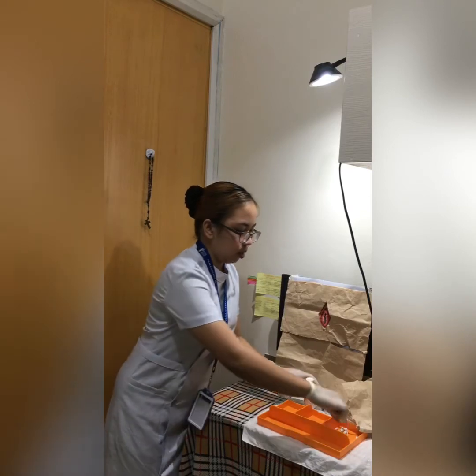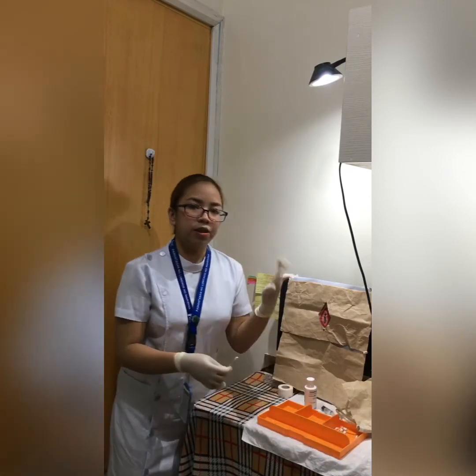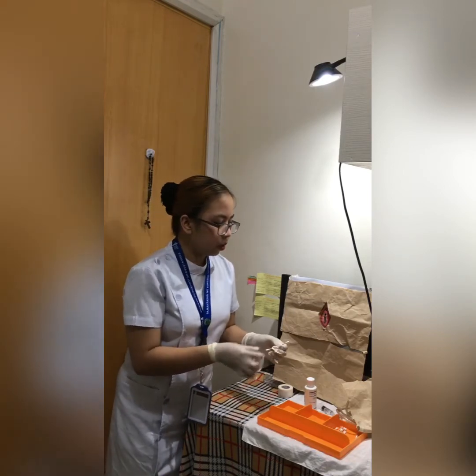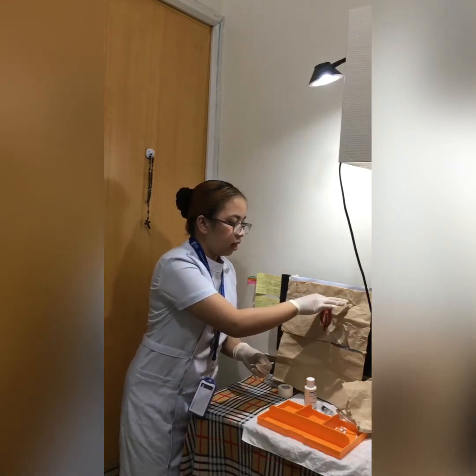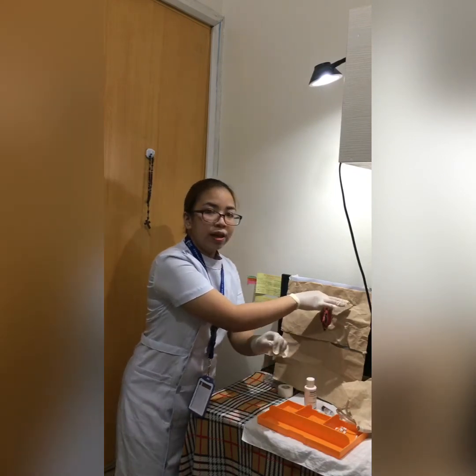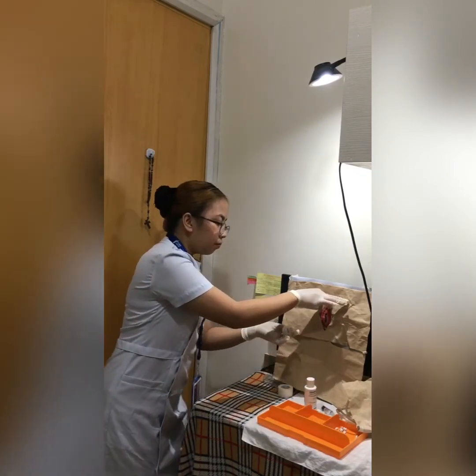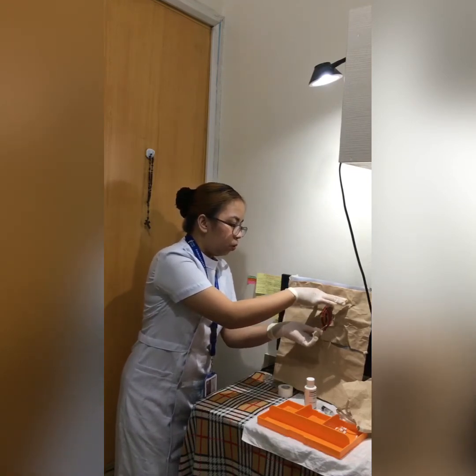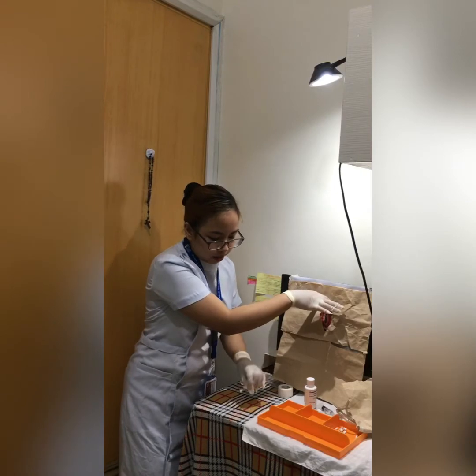Using your non-dominant hand, I'm going to hold the labia of the client and put betadine on the side farther away from me. One swab, then discard.